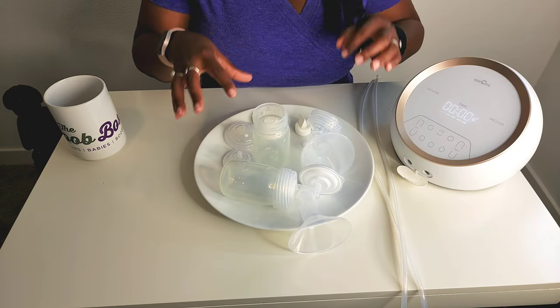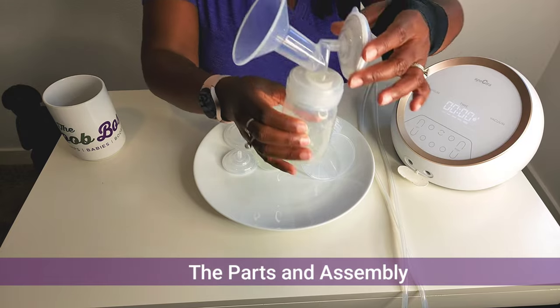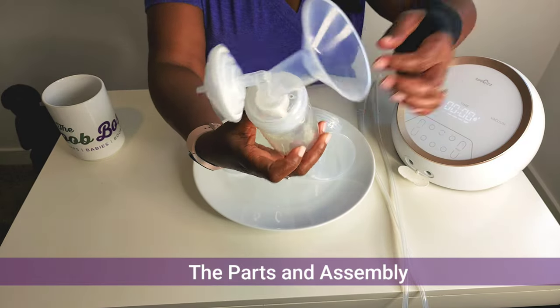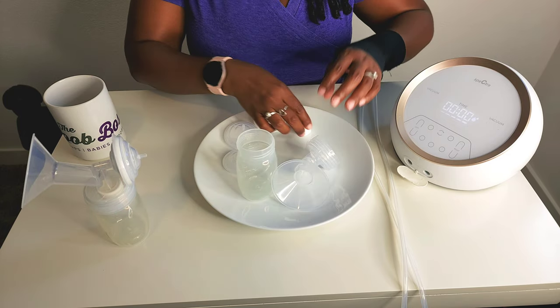Before I show you how to use it, I'm actually going to do a live pumping session. I want to show you all the different parts that come with the Spectra, as well as all the different features and buttons on the pump, and how to set them up. This is what it will look like once everything is all set up and you're ready to pump. But these are the individual pieces.